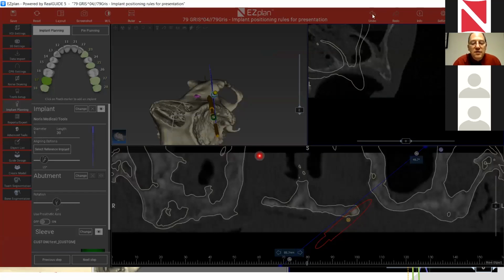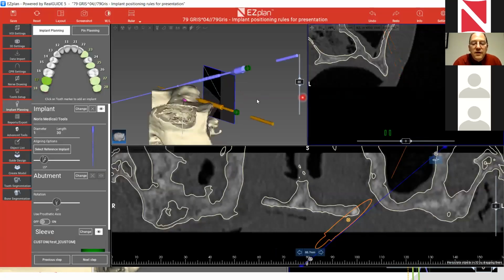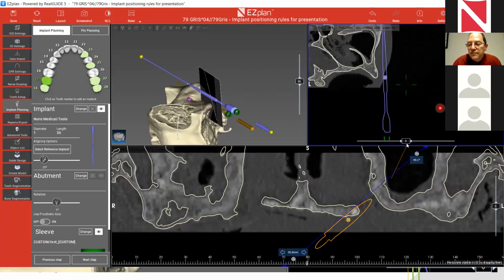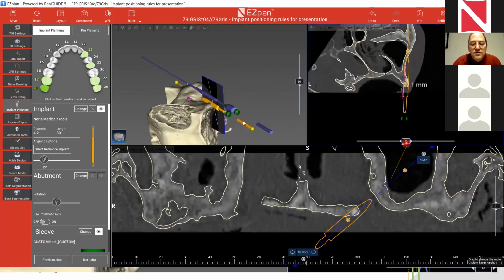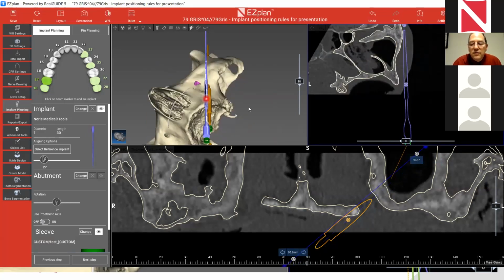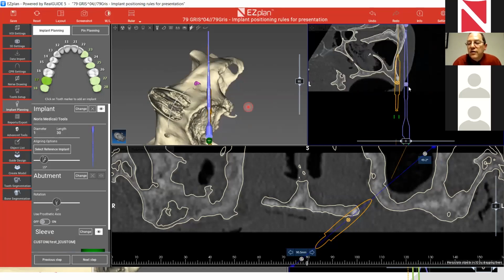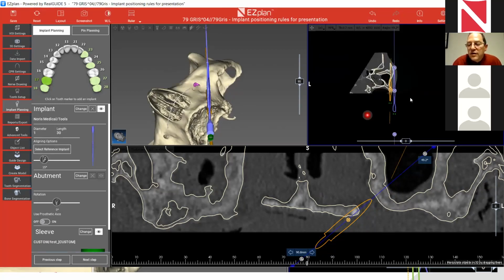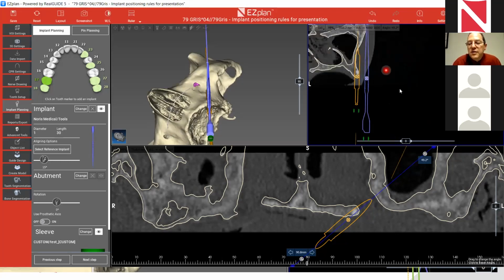Let's take it back. Yeah. Okay. I'll put the tool again this way, like that. And, yeah. I don't see it because I moved here. Okay. So I have the tool right now. I lean it on the position here. I take it until I see it parallel like that. And now I have the right distance. This is the distance I was expecting.